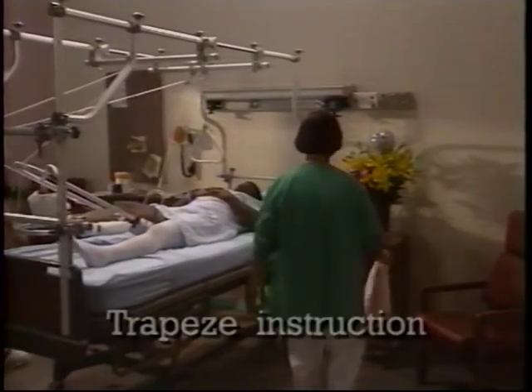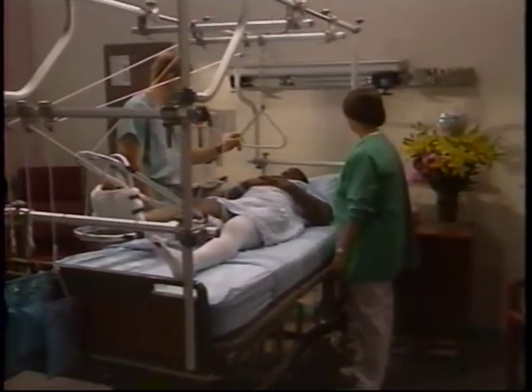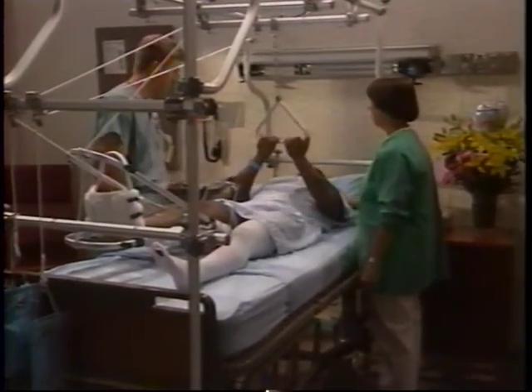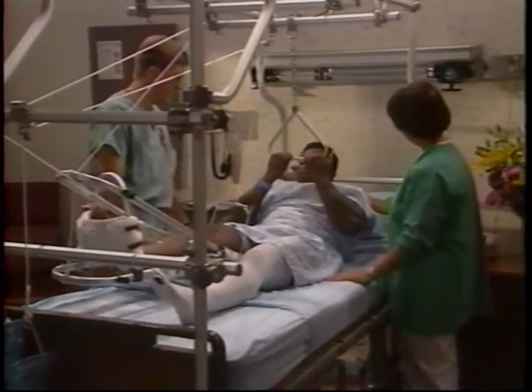Patients in traction present special challenges when providing personal care. Be careful not to bump the traction during this time. If the patient is in skeletal traction, instruct him in the use of the trapeze that hangs over the bed. Remind him that his limb is in balanced suspension, allowing him some movement without disturbing the fracture.